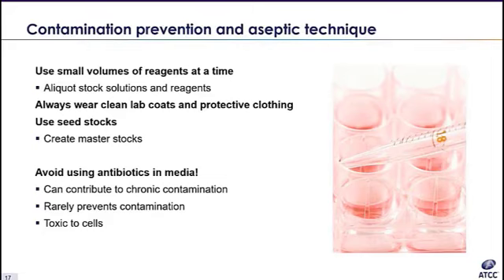Resistant mycoplasma may also get introduced along with other bacteria. The antibiotics may get rid of the larger bacteria, but mycoplasma may persist undetected. So in short, antibiotics can cause a sense of false security. When is it acceptable to use antibiotics? A few exceptions make it necessary. For instance, if you're isolating primary cells from original tissue, it may be a good idea to use the antibiotics for the first couple of weeks.